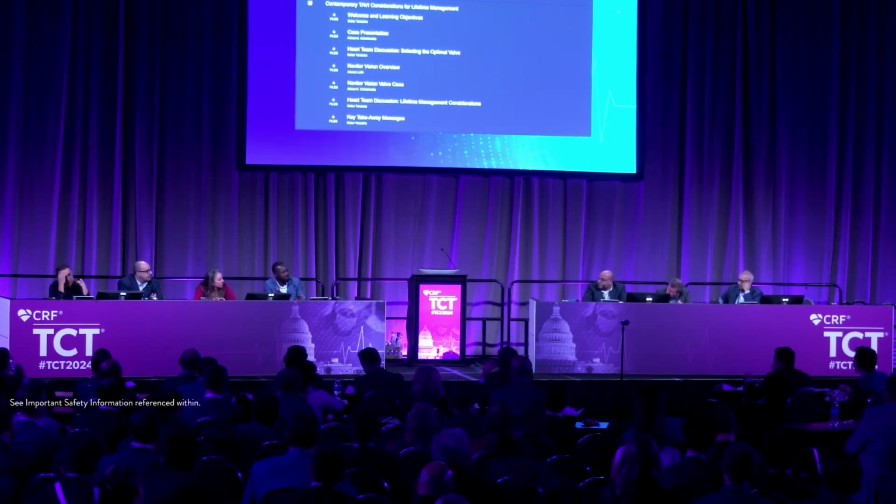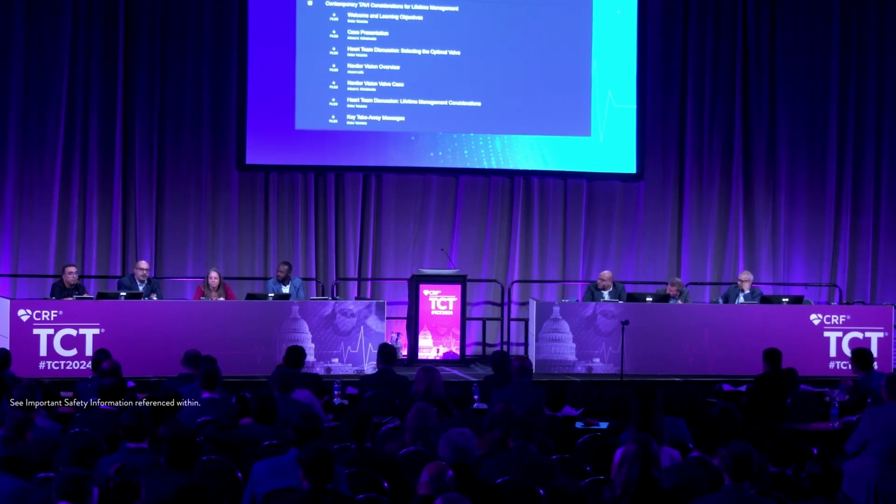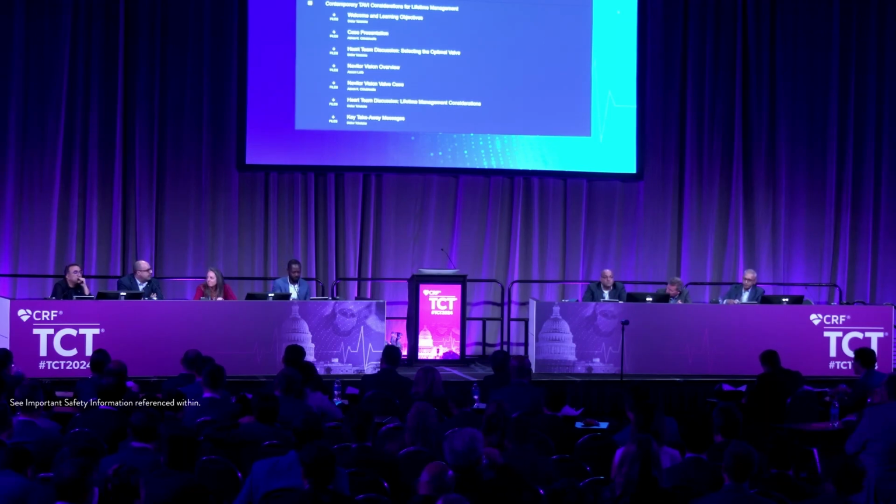On large annulus, we understand. Very small annulus, does it impact your decision making? No, it's a great question. At 80 years old, I doubt, no matter what annulus size, the question would be surgery versus TAVR. What would drive my decision is mainly what is my next option for lifetime management. And as long as I have an option to manage the patient later on, and he's a tricuspid valve, whether he's 75 or 80, it's going to be TAVR first.